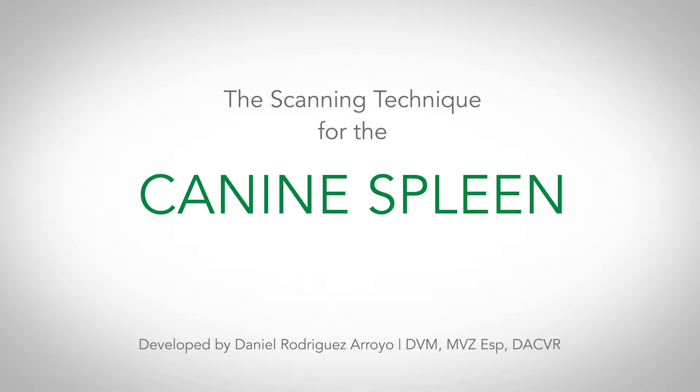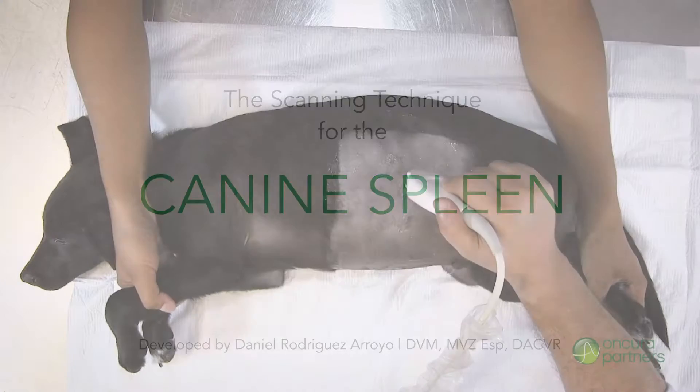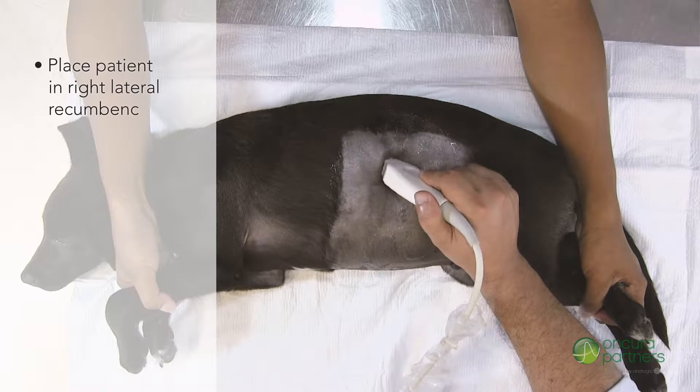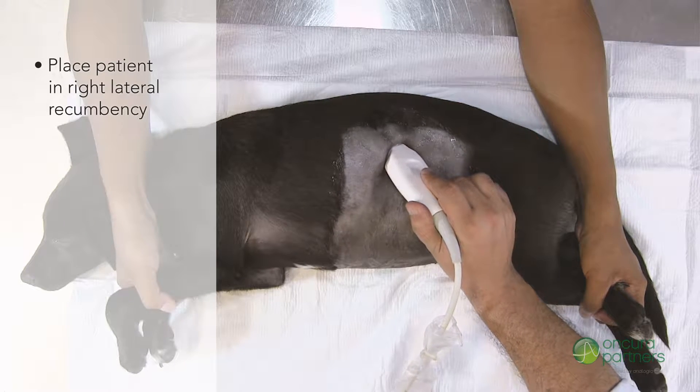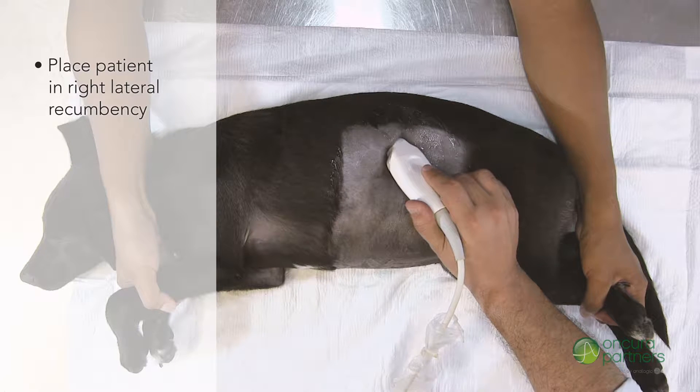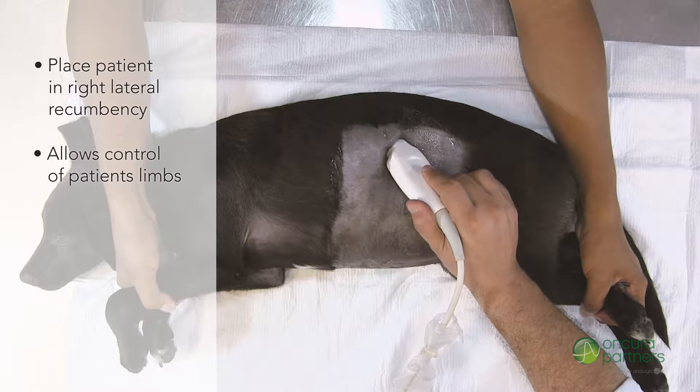The scanning technique for the spleen in lateral recumbent canine patients. For this technique, place the patient in right lateral recumbency with their feet directed towards the sonographer. This position will allow one other person to have control of the patient's front and hind limbs.